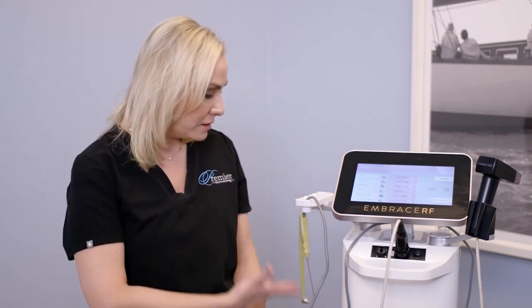So I wanted to give you a few more details about this device. There are 2 different treatment modalities on the Embrace platform. The first one is Morpheus, which is the radiofrequency microneedling, and the second is the AccuTite or face tight or body tight, depending on where you are using the device. It's called different things. The fascinating thing about the combination of these treatments is that they can be used to eliminate tiny areas of unwanted fat by using the AccuTite, face tight, or body tight handpiece first in areas such as under the eye where there's extra fat, under the chin, and on the back of the arms as we showed in our treatment today. You can use it on thighs, above the knees for the extra little bulge there, inner thighs, and on the abdomen as well.